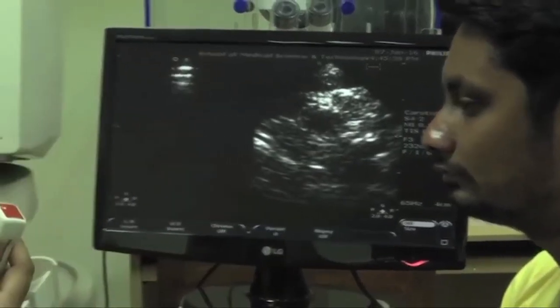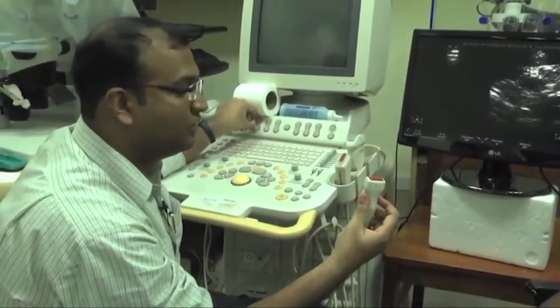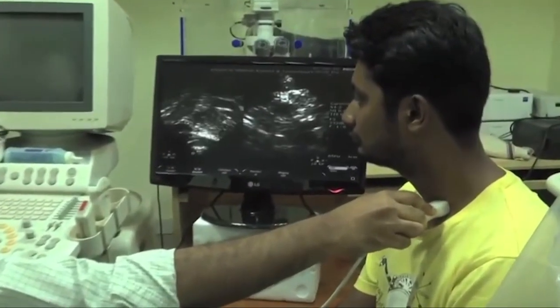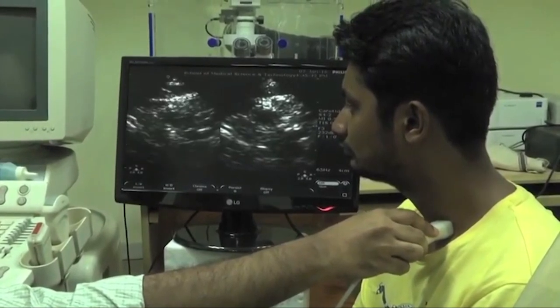And this LR invert is what is inverting my reference. So if my reference is like this and I want to invert it out, then I can use my LR invert to have the same thing. And similarly, you see there is an up down invert option over here. So this will do a vertical flipping of my image as well.